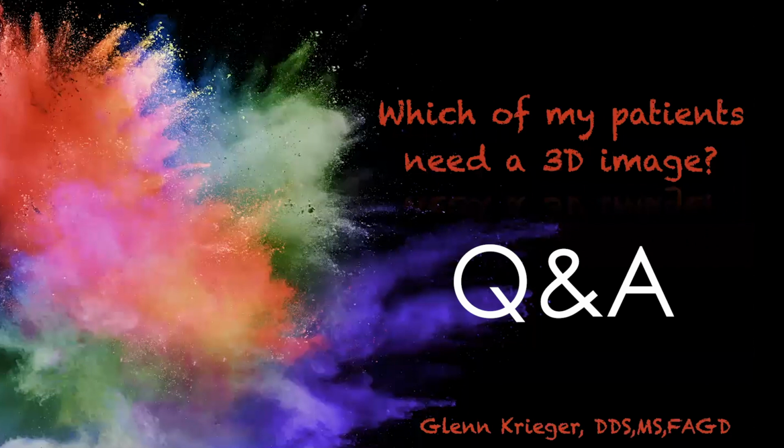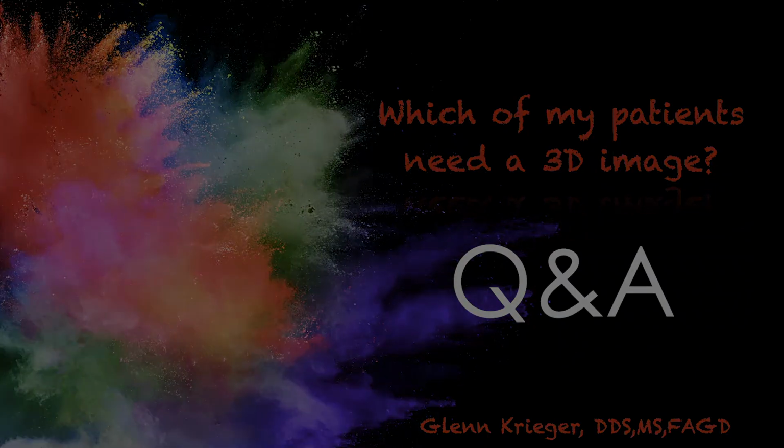Can we use CBCT instead of 2D X-ray to avoid the exposure to radiation? For what application, I guess, is the question. For restorative dentists, no. I think CBCT is like flying in a plane at 30,000 feet. You get a lay of the land, but I'm not going to diagnose decay from it. I'm not going to diagnose perio disease from it. For ortho, absolutely. It takes the place of pan and ceph, absolutely.